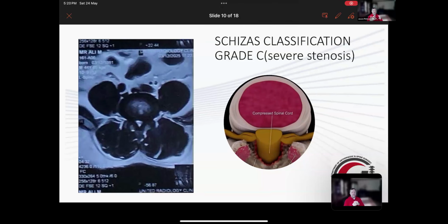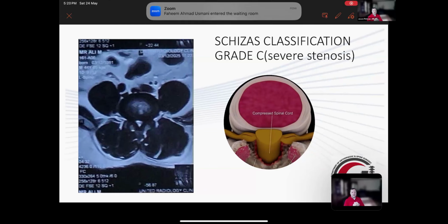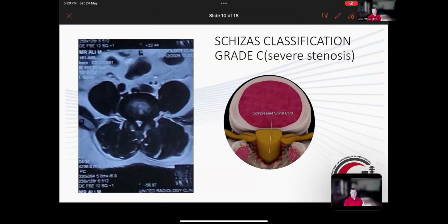You saw a very nice central decompression in this case with the biportal technique. The biportal technique allows you to achieve exactly what you would down a tube, but with an endoscopic footprint. The uniportal technique focuses more on minimal bony disruption and a true resection of the ligamentum flavum.